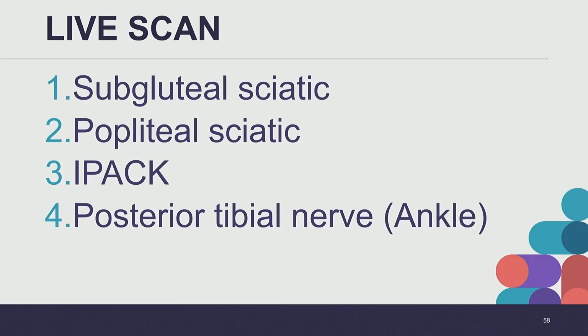The probe is right in that popliteal fossa first. So you can see there's condyles. So you see both bony structures, the medial and lateral condyle there. You can see the pulsatility of the popliteal artery. Right now I'm really tilting my probe into the knee.